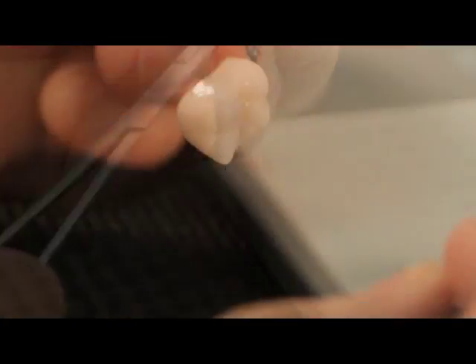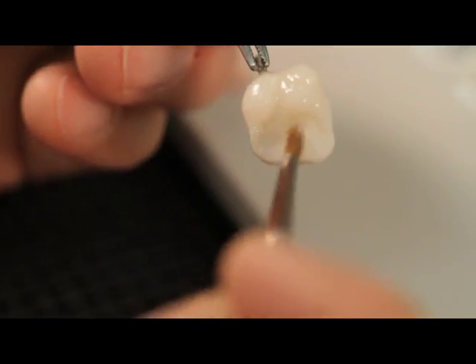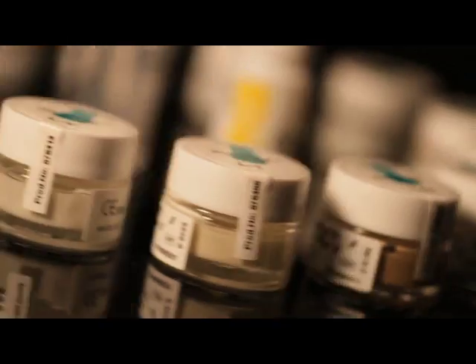The Lustre Paste NF are a one-for-all solution for the complete Initial line from GC. It is possible to use the Lustre Paste NF in a wide CTE range between 6.9 and 13.3, in order to work with nearly all types of ceramic.